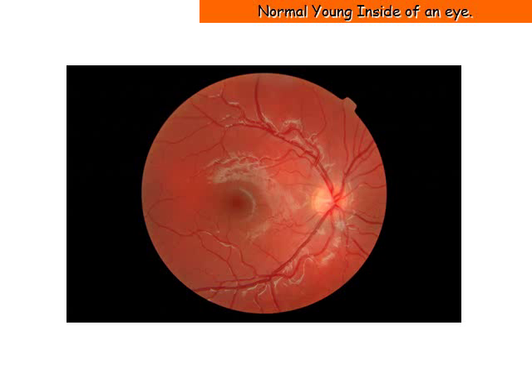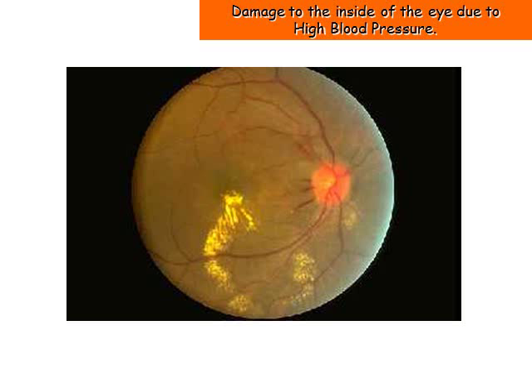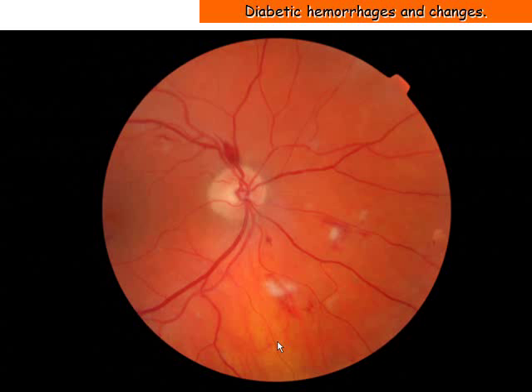We see in this image a normal young inside of an eye. Here we have an example of an eye that has damage to the inside due to high blood pressure. The whitened areas show the vessels that no longer receive sufficient blood supply — these areas in the eye are no longer able to see. This image shows diabetic hemorrhages and changes.